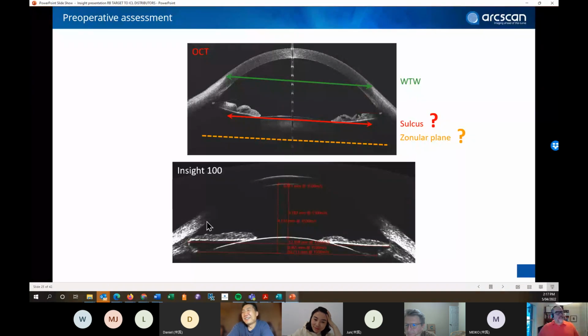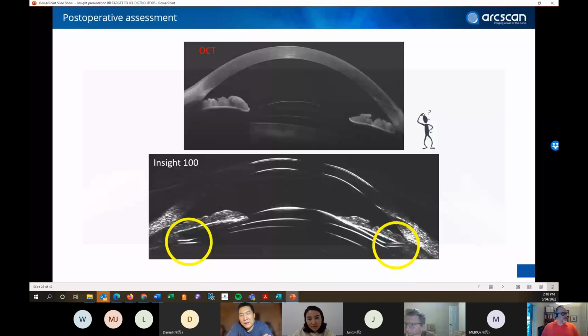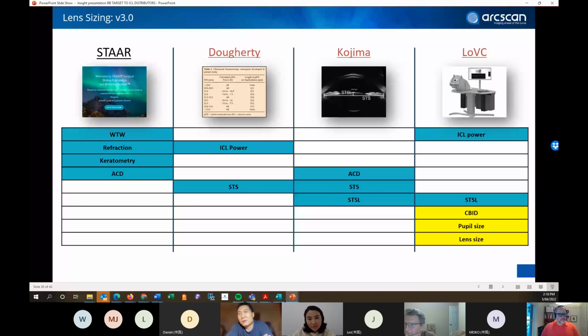If we want to have a cornea image, we're going to move the focal area to the cornea plane, and we're going to have a really good image of the cornea. And that is what we do when we're analyzing keratoconus. So when we evaluate keratoconus, basically, you can choose the focal area to do the image.